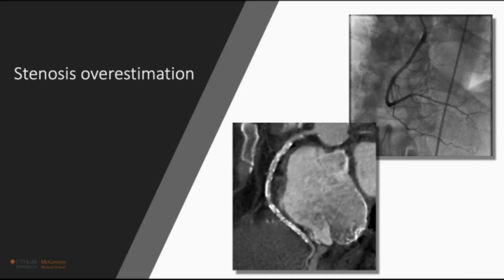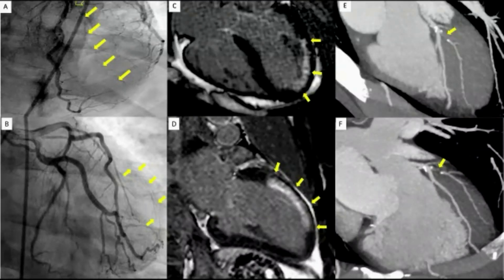But until that happens, I think we can use other tools like myocardial perfusion, respectively, or CT-FFR to delineate whether these lesions are indeed significant or not. Sometimes we see more than the interventional cardiologist will see.